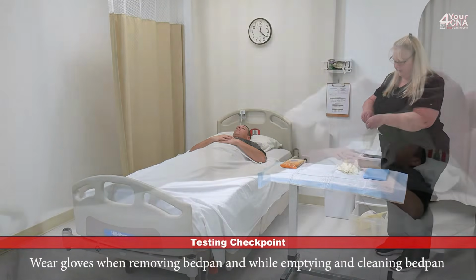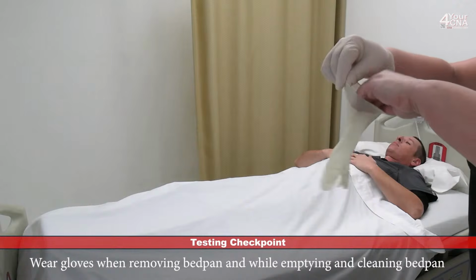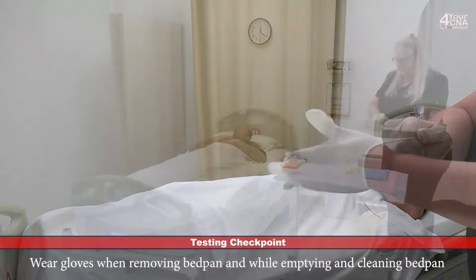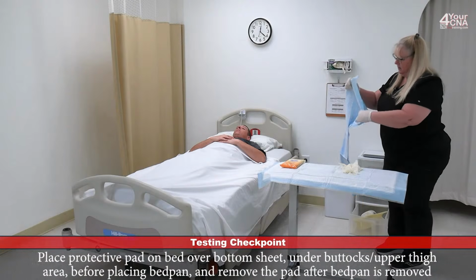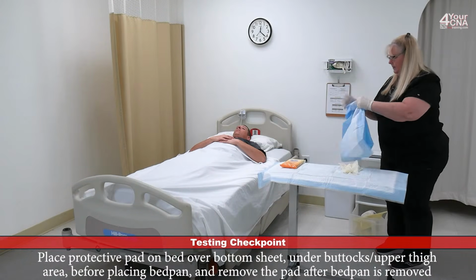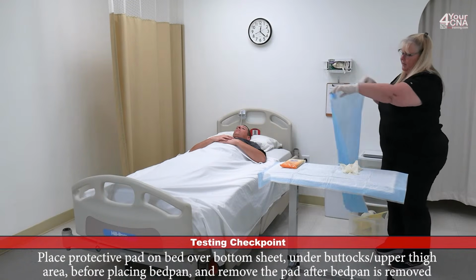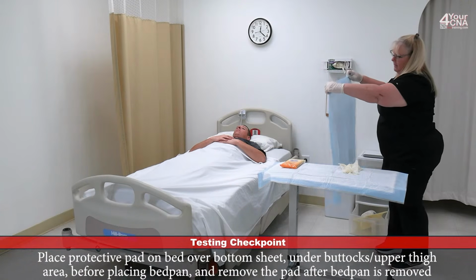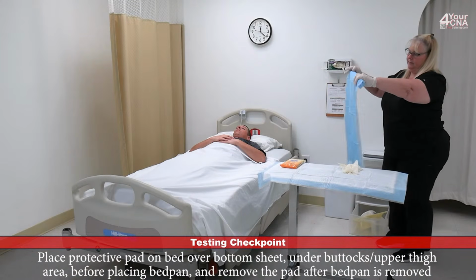We'll go ahead and put the gloves on. I'll take the barrier and prepare it by holding it up with the absorbent side facing me, and I'm going to roll it toward me.